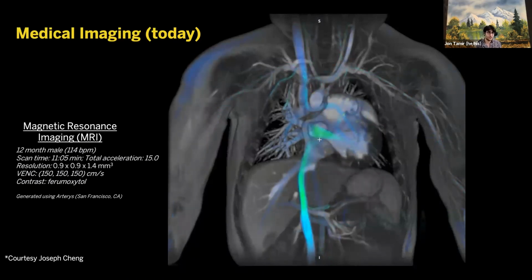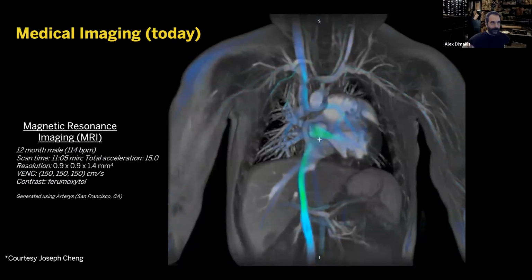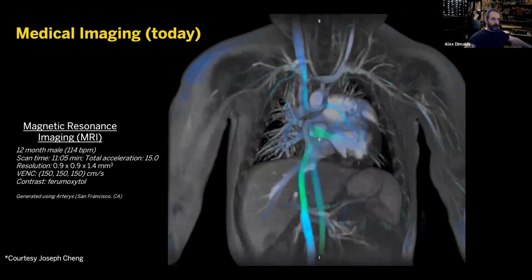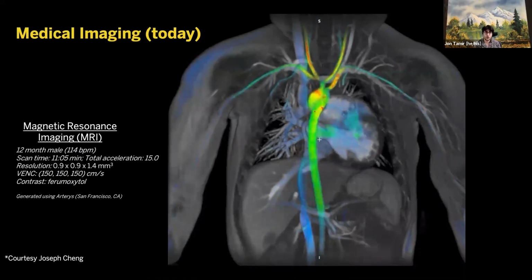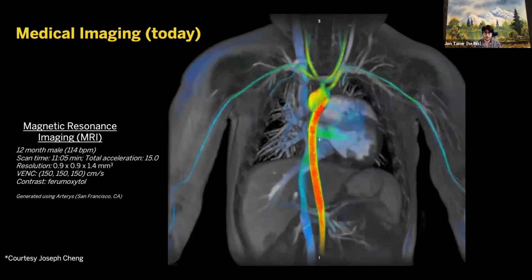Okay. But there's almost never a 1000 by 1000 MR image used for diagnosis, at least not at acquisition time. Is that because the computation is a problem, or we don't have enough measurements, or what's the problem, or it wouldn't even be useful? No, it could be useful in moving to higher field. So really, the issue is always it's a scan time versus SNR versus resolution trade-off.